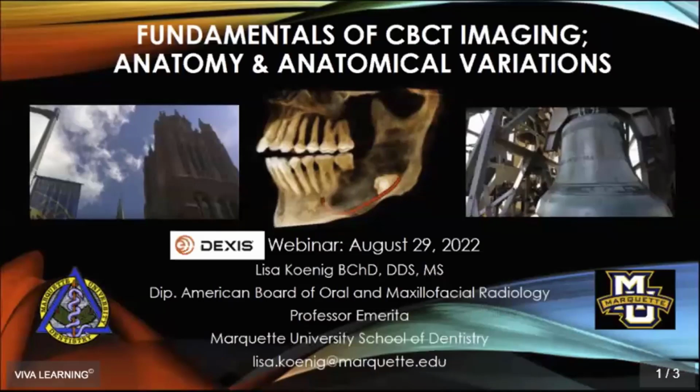Let me look here, what else? Can you go through the TMJ assessment? What features of condylar heads and glenoid fossa do you look for to differentiate normal versus abnormal? Well, that is another webinar, as I mentioned. We just did not have time to cover every single thing. We didn't have time to cover the temporomandibular joint or the airway. So that would obviously be another seminar.